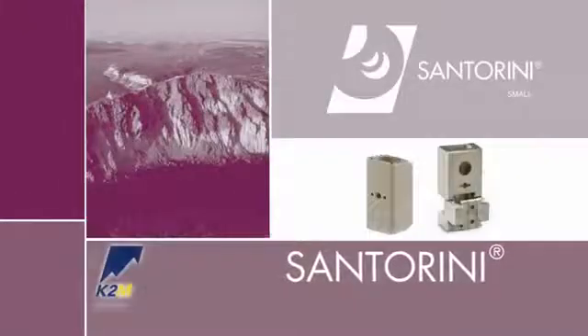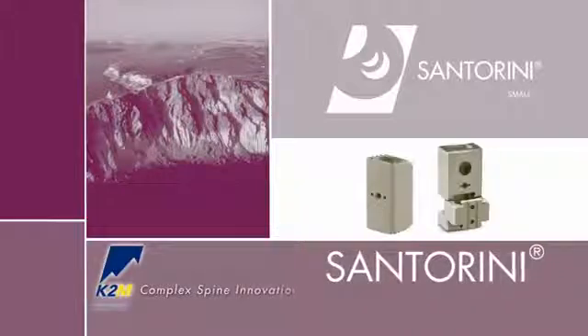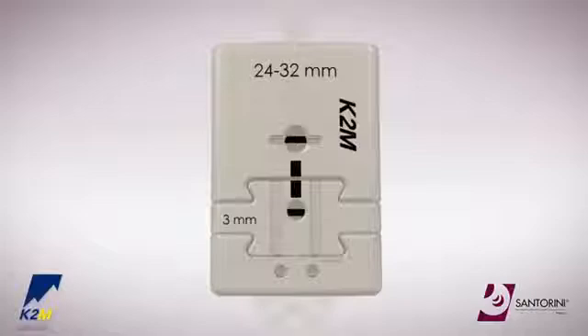Introducing the Santorini Small Corpectomy Cage System from K2M, Complex Spine Innovations. The following technique refers to the implantation of the small expandable corpectomy cages.